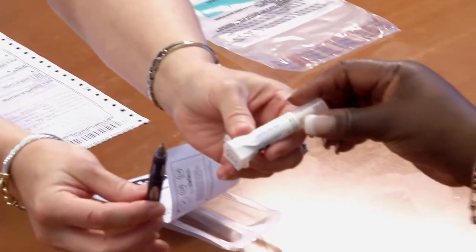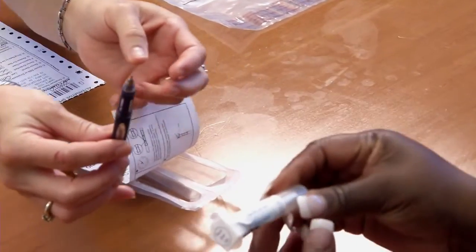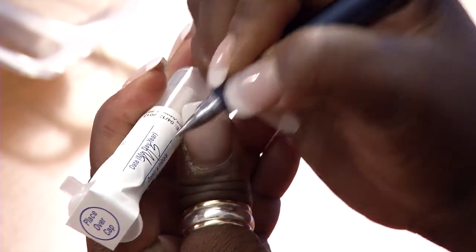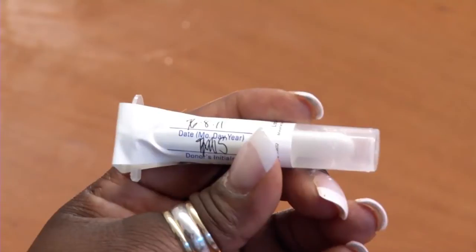Ensure the label is affixed and secure over the top and down the sides of the specimen collection tube, as this will eliminate the possibility of specimen tampering. After the seal is affixed to the collection tube, the collector dates the seal and the donor initials the seal.